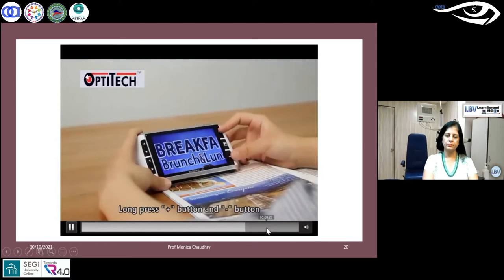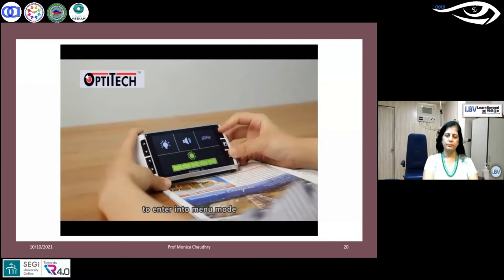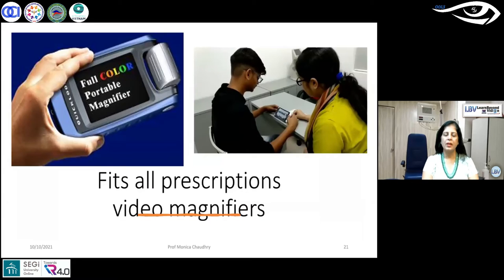Long press the zoom in button and zoom out button at the same time for 3 seconds to enter into menu mode.